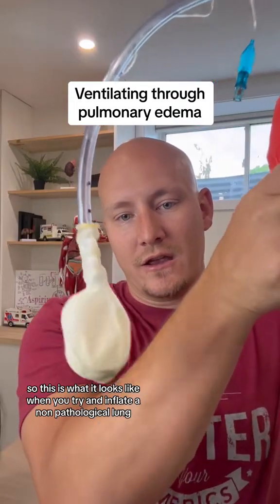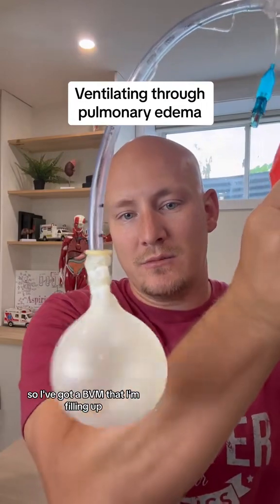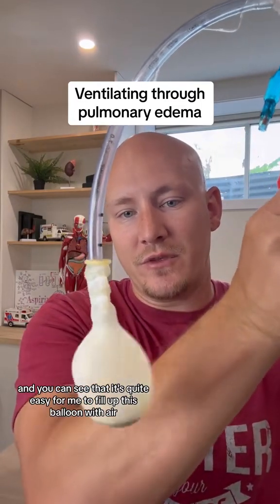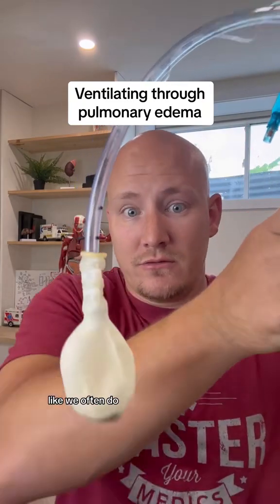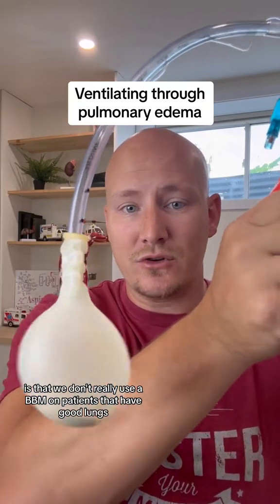This is what it looks like when we try and inflate a non-pathological lung. I've got a BVM that I'm filling up, and you can see that it's quite easy to fill this balloon with air. But what if we had pathology? In practice, we don't really use a BVM on patients that have good lungs.